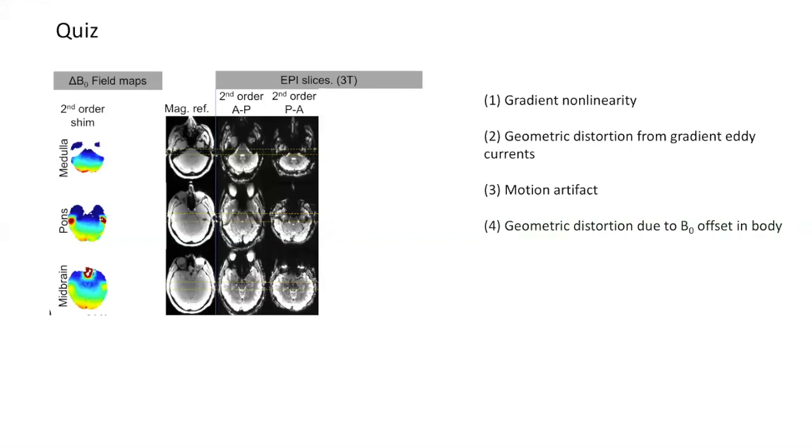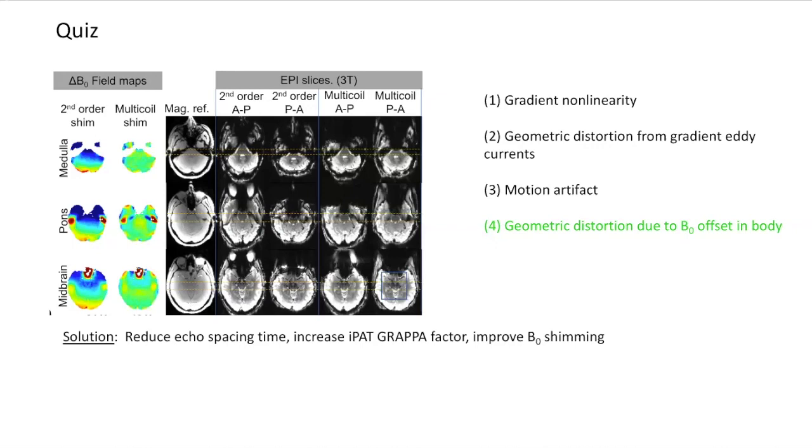I guess we had one more, but I'll just let you know. You get these geometric distortions that Jason Stockman has been working on, creating a special coil to help improve the shim and basically improve ultimately your B0, which significantly improves the images. So if you're interested in this and need some help with this issue, talk to him. He'll be happy to help, I'm sure.